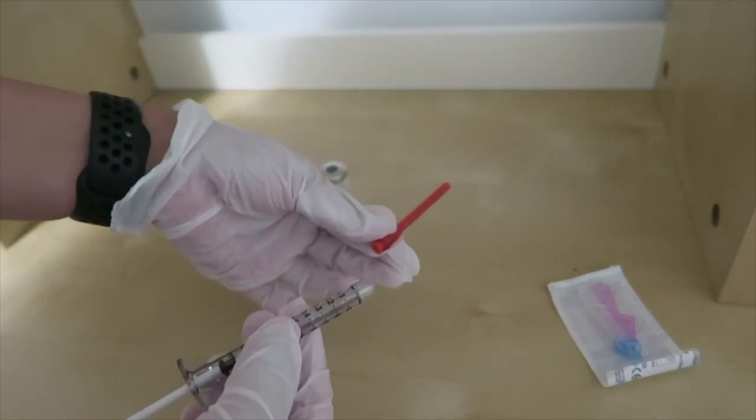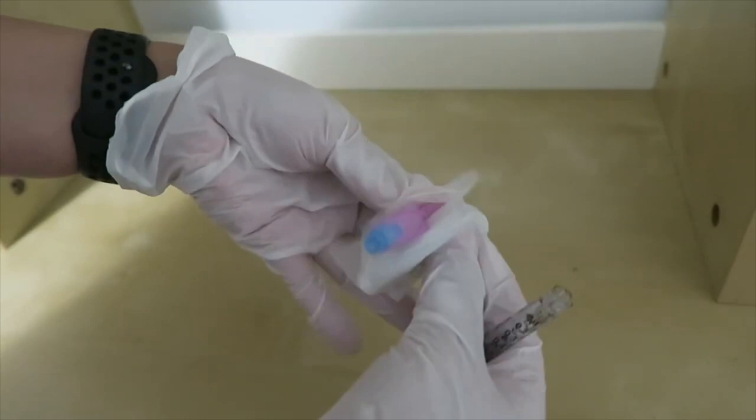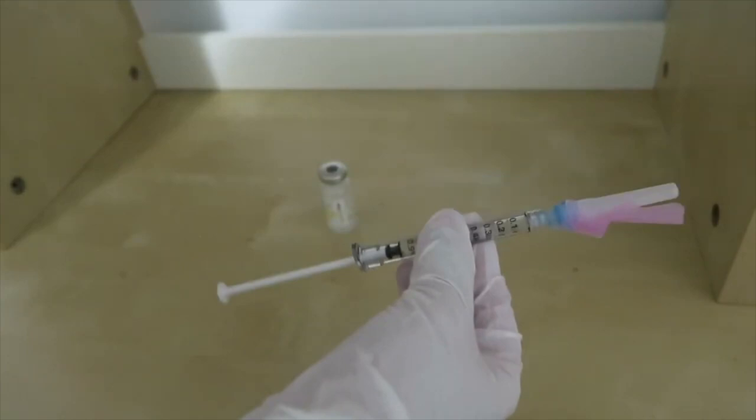And now I am changing the needle and putting in the needle that will be used to administer this injection. And now the medication is ready to be administered.